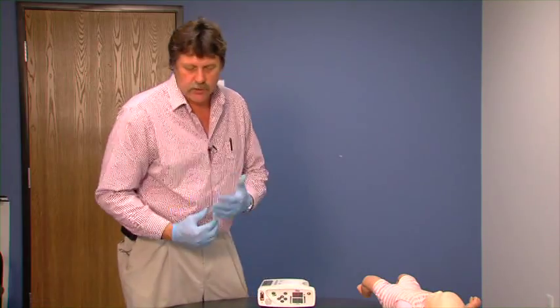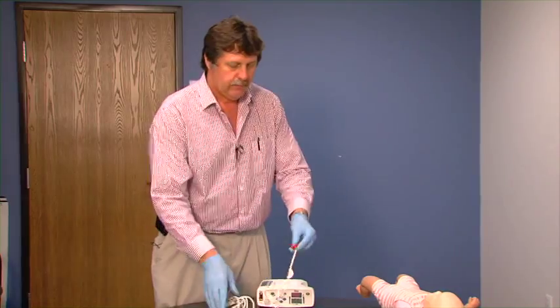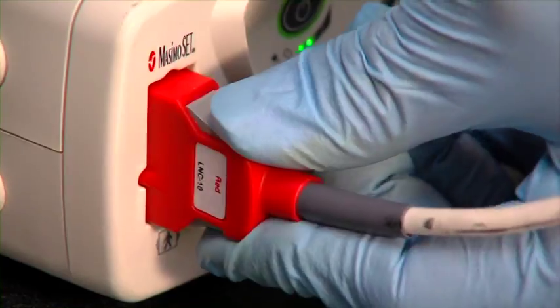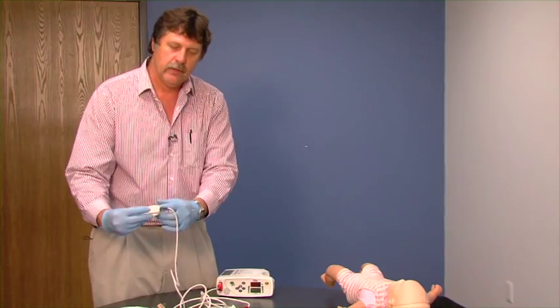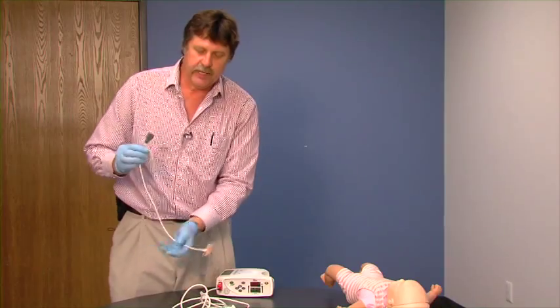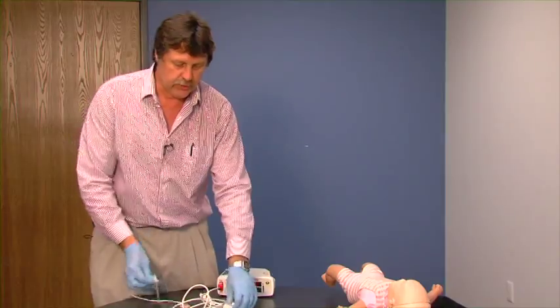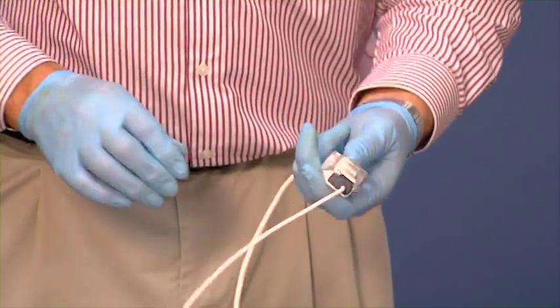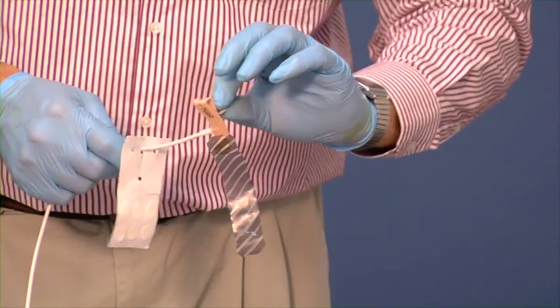We need to hook up our sensors to the machine, starting with our patient cable. The patient cable plugs directly into the front of the machine. On the other end, we're going to use either the finger probe or, as in this case with an infant, we're going to use the adhesive wraps to wrap around the patient's foot. So we secure that and wrap this around the patient's foot.